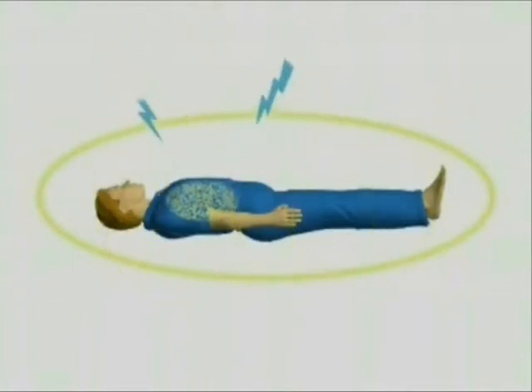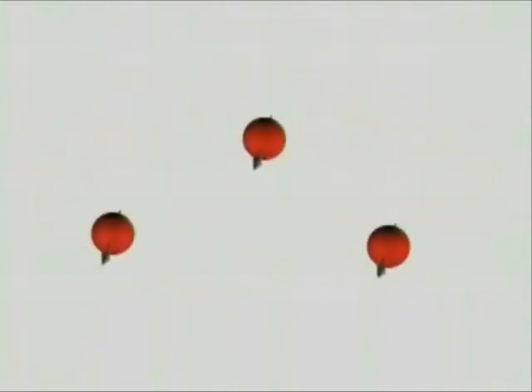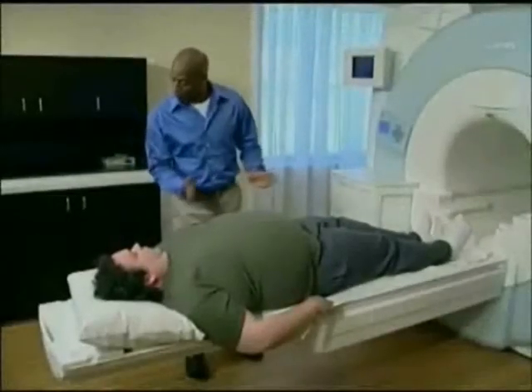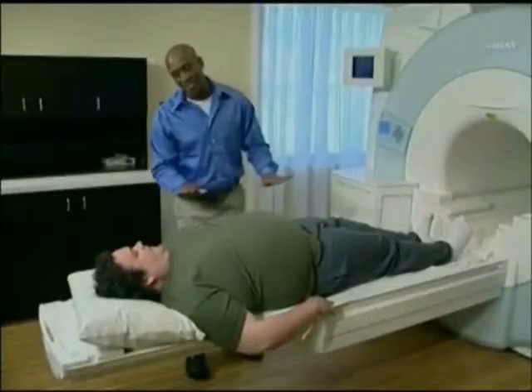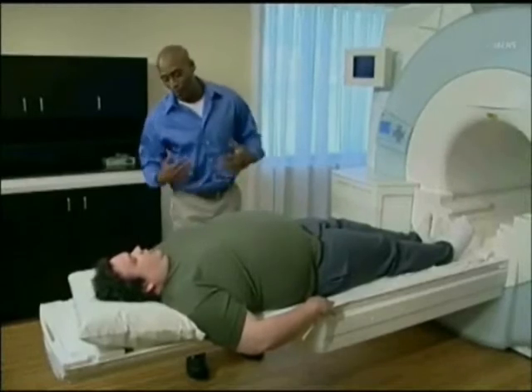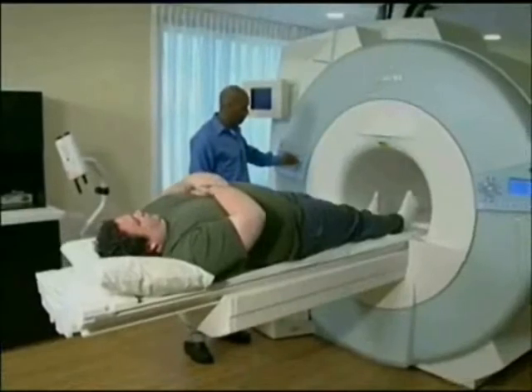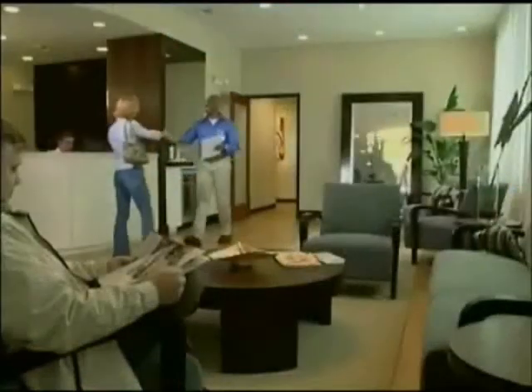Different signals emitted by different body tissues are then used to differentiate individual anatomy. When tissue is damaged, its composition changes and gives off uncharacteristic signals. It's distinguishable from surrounding healthy tissues. Once again, it is important to point out that MRI utilizes a magnetic field and radio waves. Patients are not exposed to X-rays or other ionizing radiation.